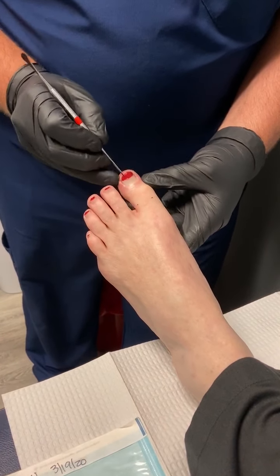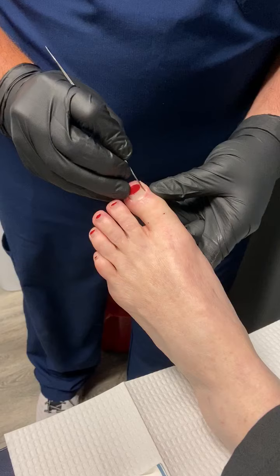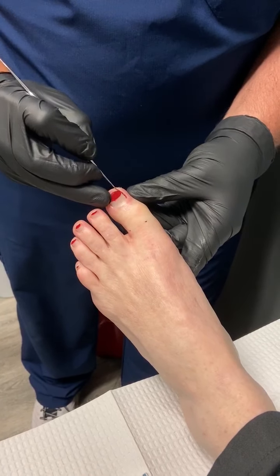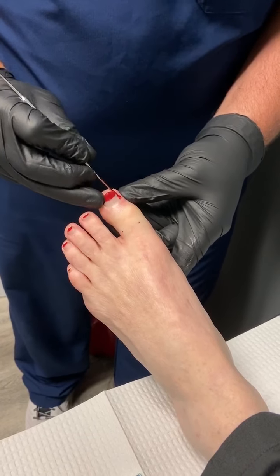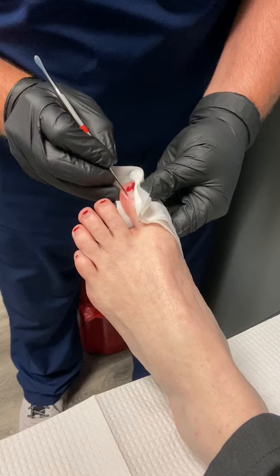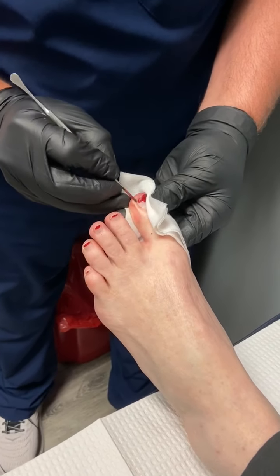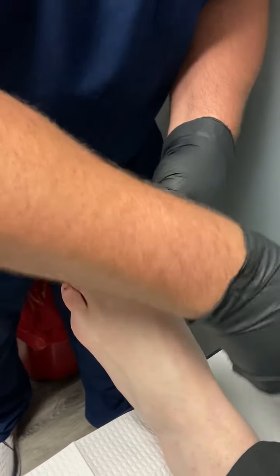She's ingrown on this corner and this corner. This is called a spatula — nice and flat. We're going to slide this down this side, release that, and slide out and under the nail. No pain, right? Good. You'll feel a little bit of pressure. Yeah, that's what I feel. And now we're going to do this side — slide under the cuticle, down the corner, under the tip of the nail. Feel it pop.